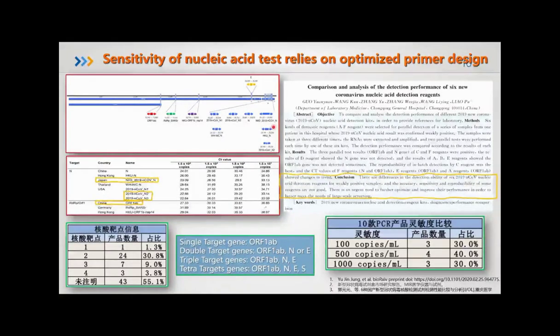So in the market, the China government also approved 7 detection kits with a fluorescent PCR method. And more than 100 related nucleic acid diagnostic products are applying for the certification from CFDA, meaning they are currently for research use only.